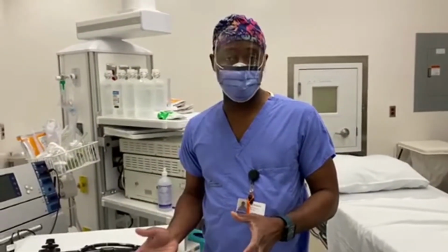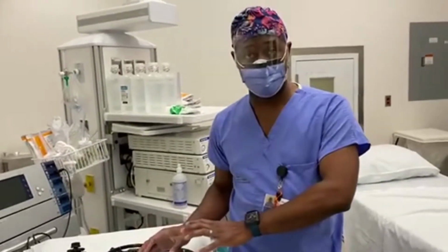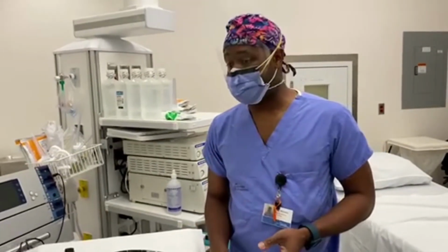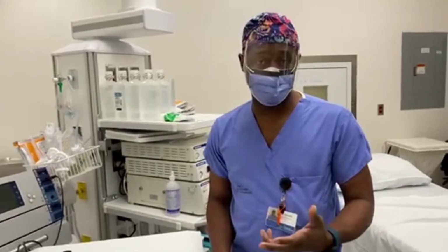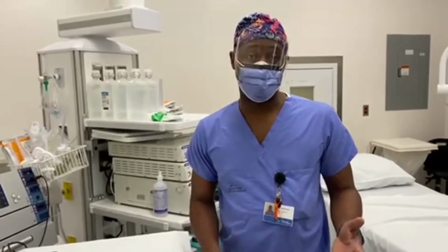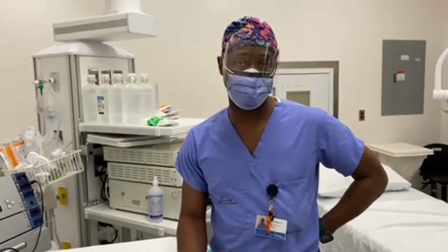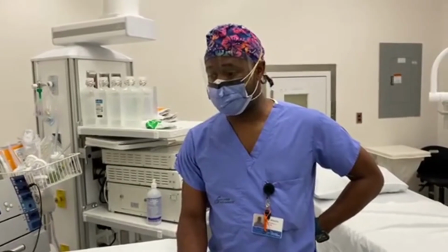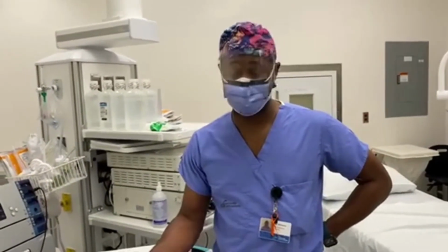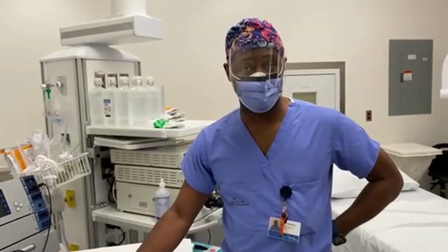There are a minority of procedures that are done in these endoscopy rooms that have nothing to do with the GI tract. For instance, we do bronchoscopy, so upper respiratory tract inspections as well. And I have special colleagues, 2 colleagues here at Dartmouth General that provide that service. And then there are a couple of urologists as well who spend some of their time in the suites here doing urologic procedures. But the bulk of the procedures done here are done by gastroenterologists and general surgeons using either a gastroscope or a colonoscope.